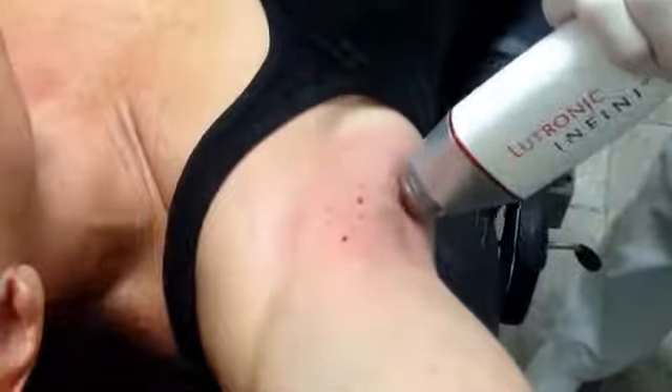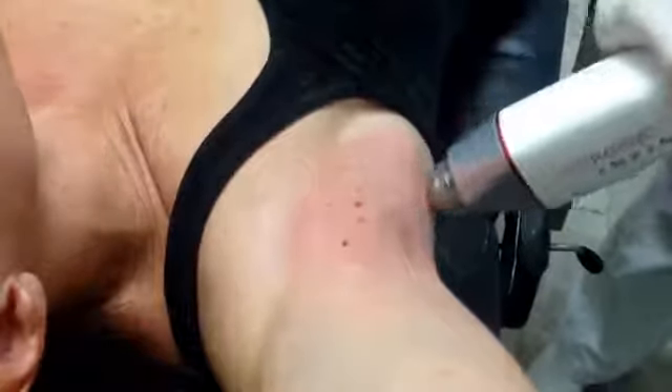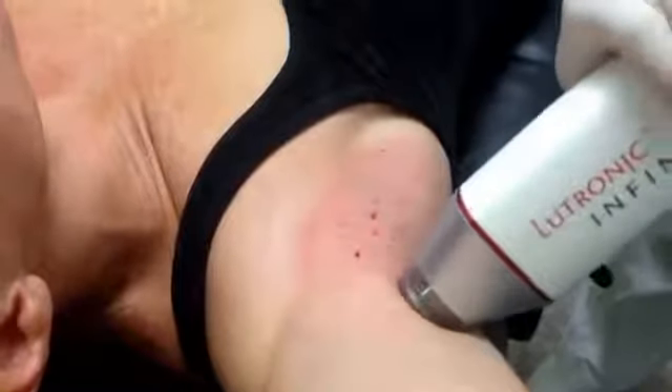It's all done under topical numbing cream without any injections. Afterwards there's practically no swelling or downtime, and there are no restrictions afterwards. That's the Infini 3D hyperhidrosis treatment.